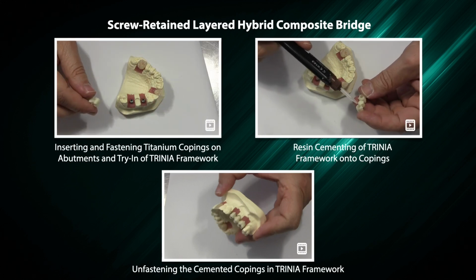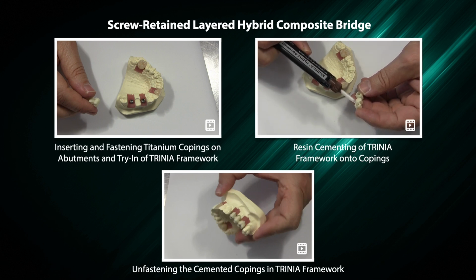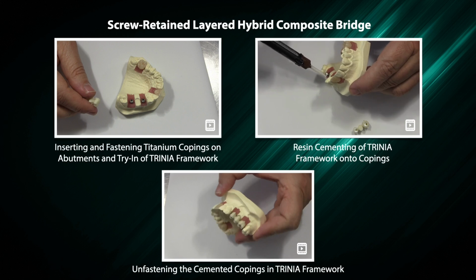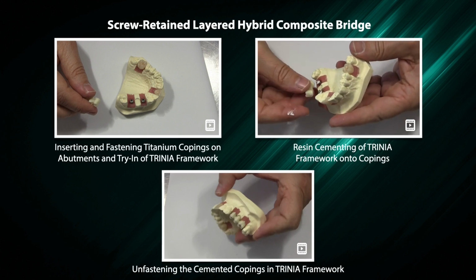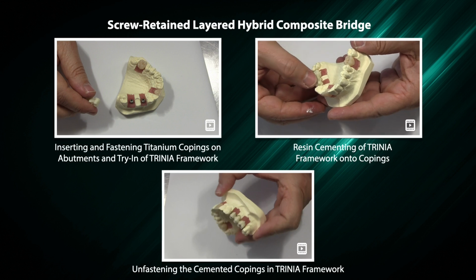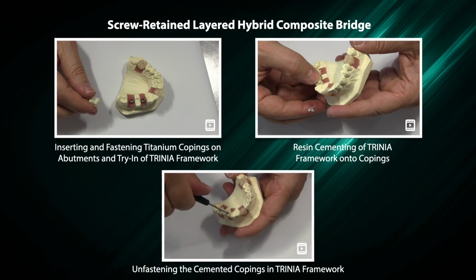Resin cementing of TRINIA framework onto copings. Unfastening the cemented copings in TRINIA framework.